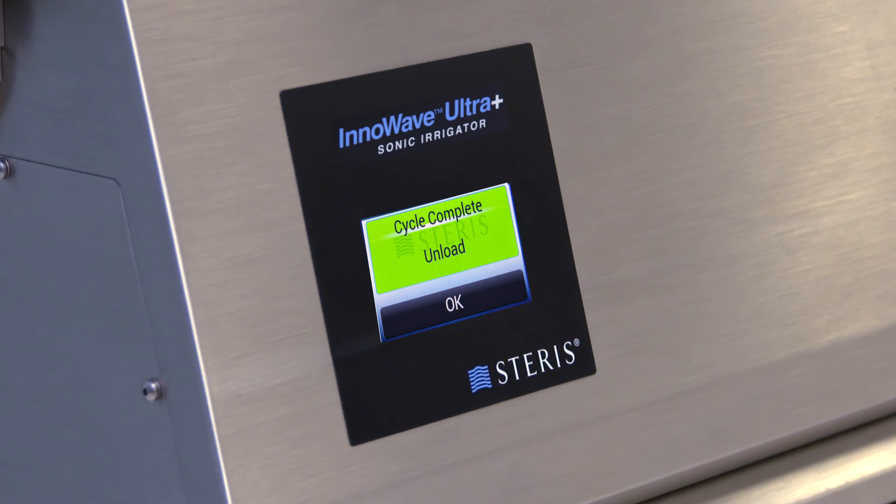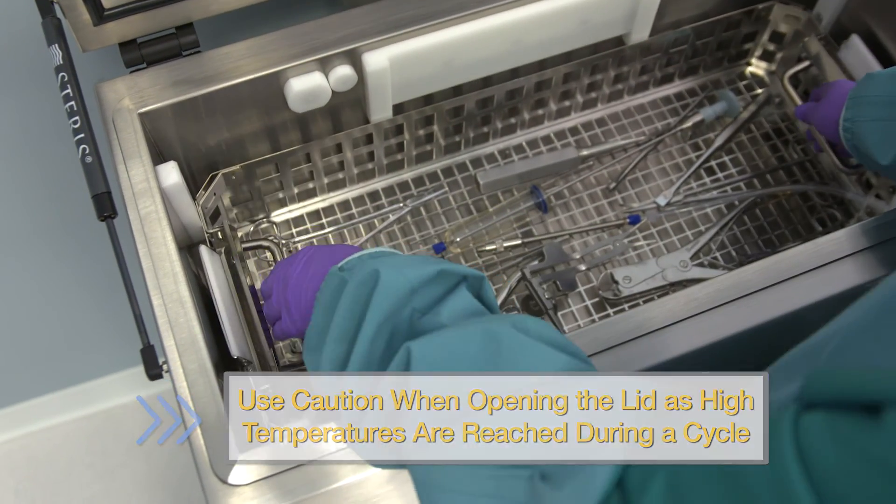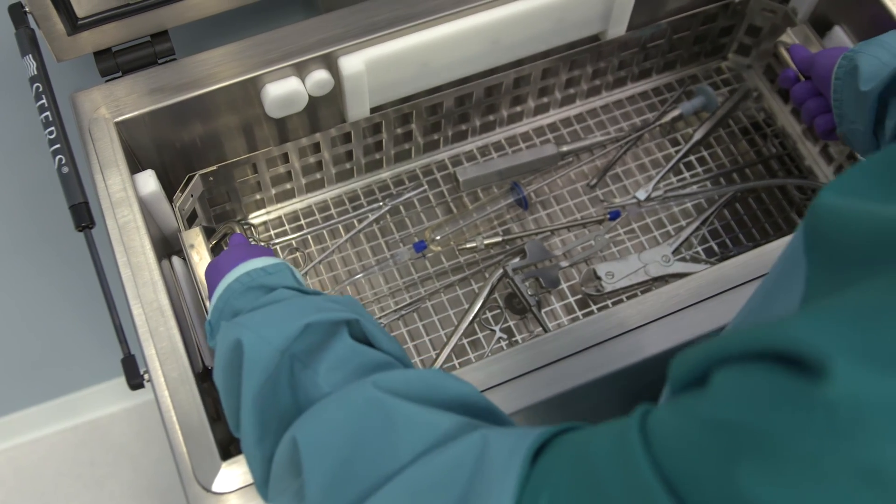Upon cycle completion, the unit will beep for one minute and display a green screen with the message, Cycle complete — unload. Press OK, then lift the lid. Pull the handle up, disengage the basket from the docking system, then lift out the basket.